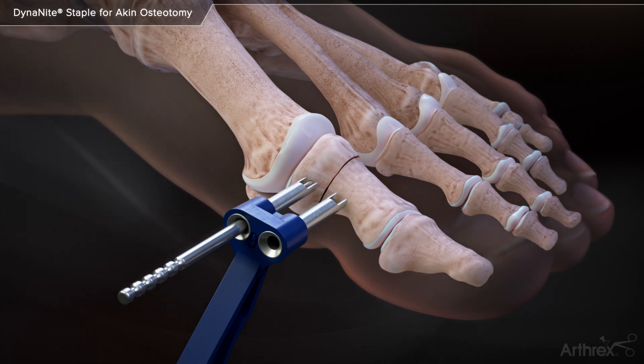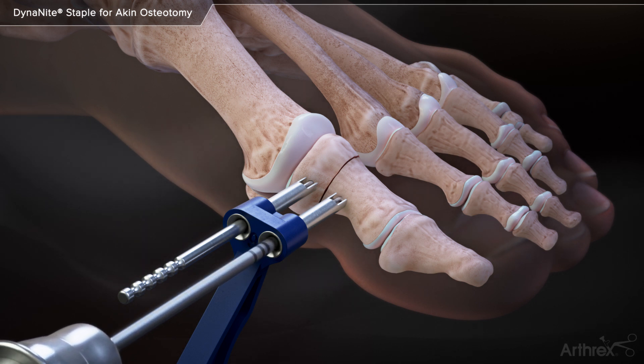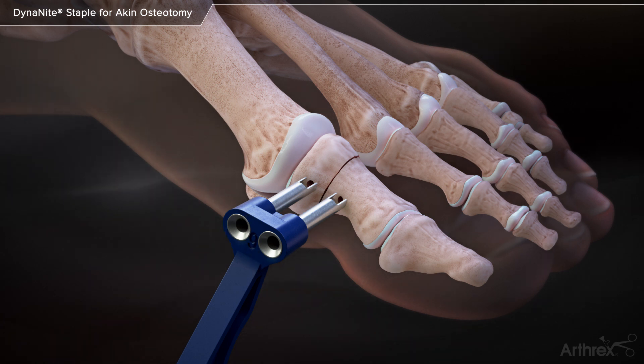If desired, a Dynanite alignment pin is inserted through the drill guide into the first drilled hole. A second hole is drilled on the distal portion of the fusion site. If desired, a second alignment pin may be used. The alignment pins are then removed from the drilled holes.